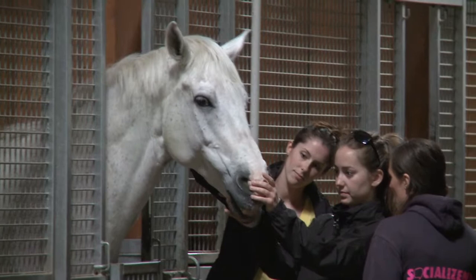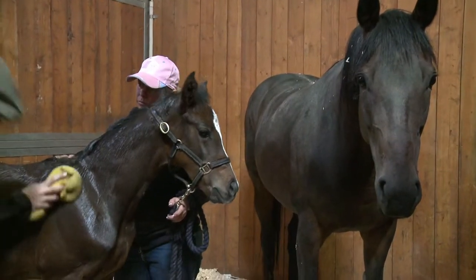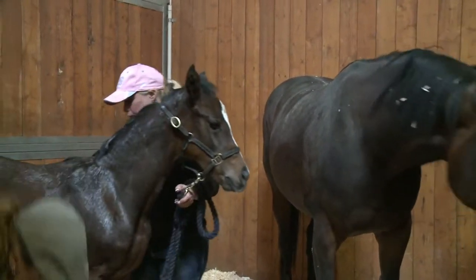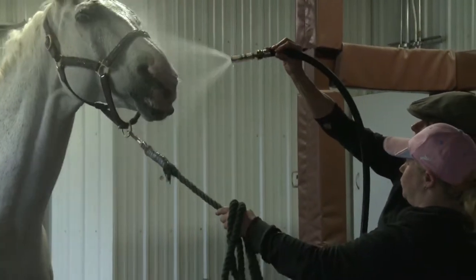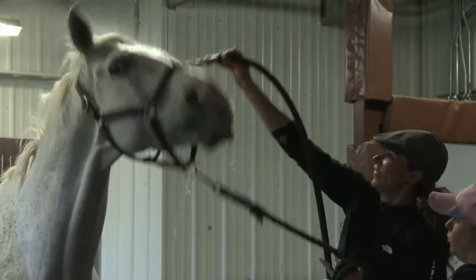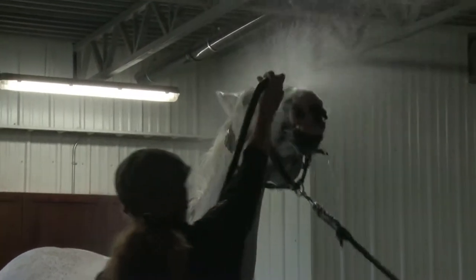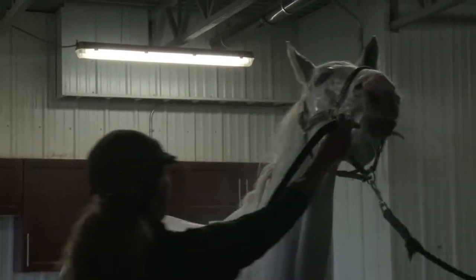We have to control the environment quite a bit. Horses are not allowed to have any liniments or oils or anything like that in their skins, in their manes, tails. They can't wear shoes in the chamber. We monitor the humidity levels in the chamber as well as around the barn for static electricity sparks. We soak down the chamber and the horse before they go into the chamber.